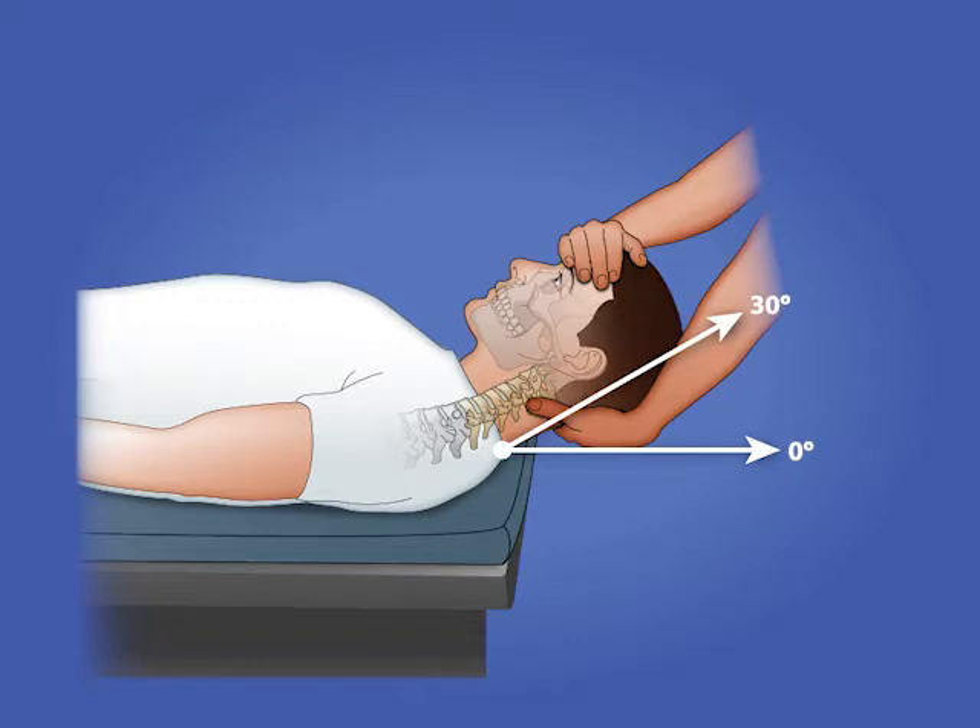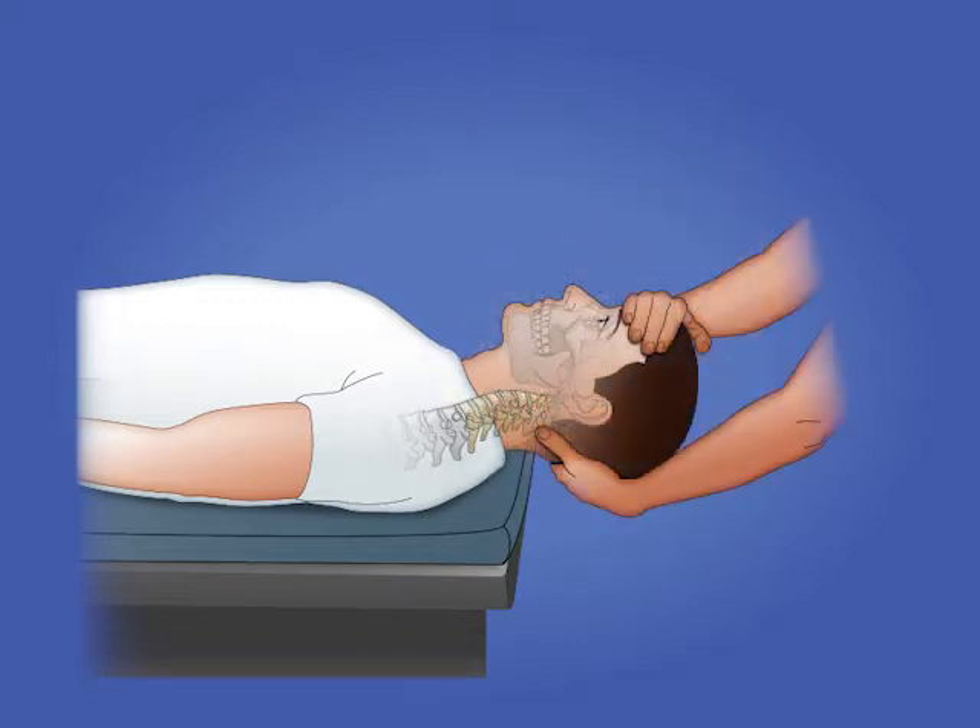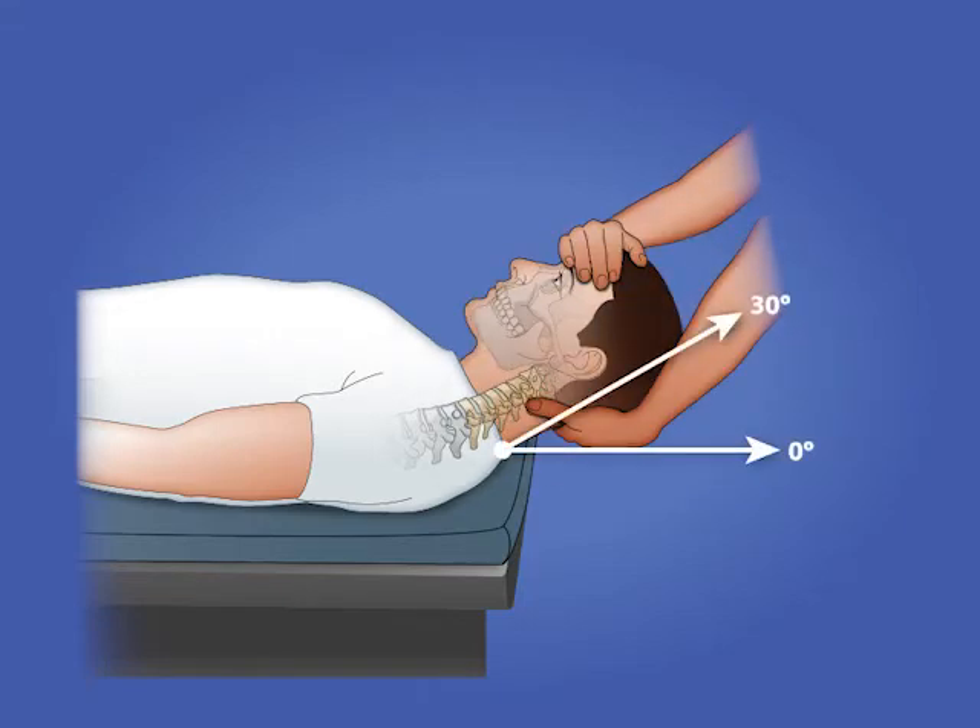The goal is for the clinician to apply equal amounts of tension on the right and left side of the vertebral bodies in order to increase separation of the cervical vertebrae.